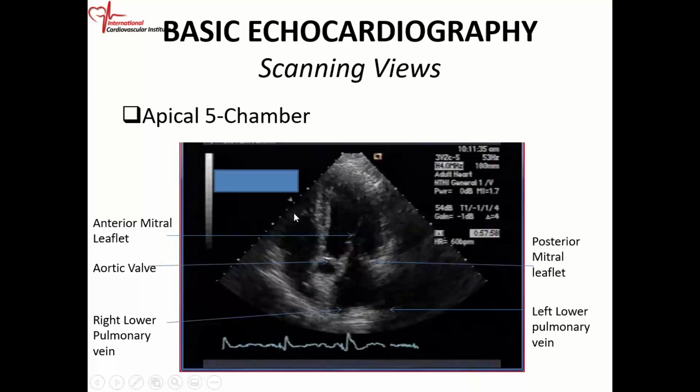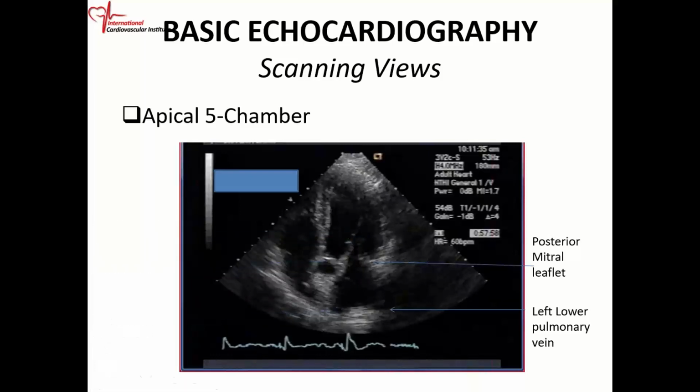The important thing, I don't know if you've seen a structure right there. This is the moderator band. The moderator band is in the right ventricle, and when you get your 5-chamber view, you can see the moderator band.